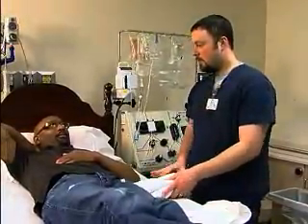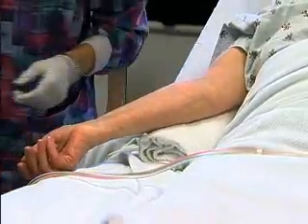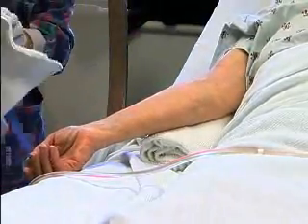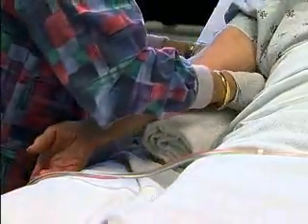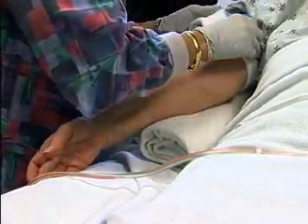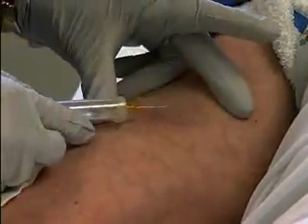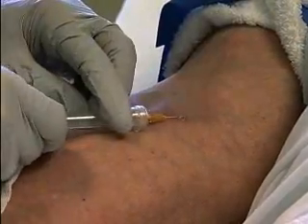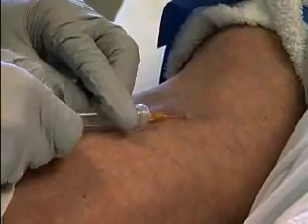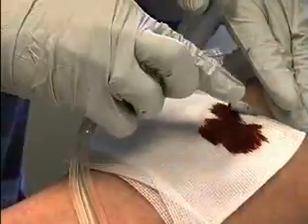associated with these procedures. Now, for the venous access, the nurse applies the tourniquet proximal to the vein that we want to puncture. The area is cleaned. Once we can see visibly the vein, we inject a little bit of the local anesthetic. Here we inject about 1/4 cc or even less of the local anesthetic. 30 seconds later, we take an angiocath.